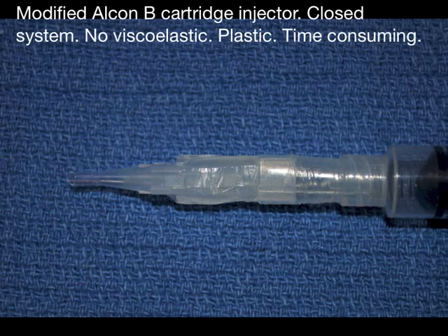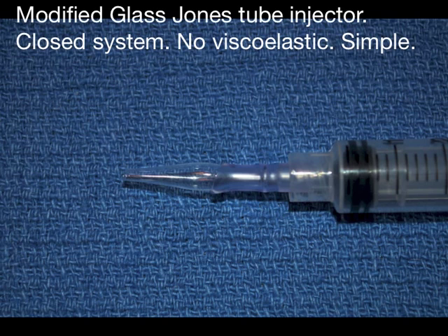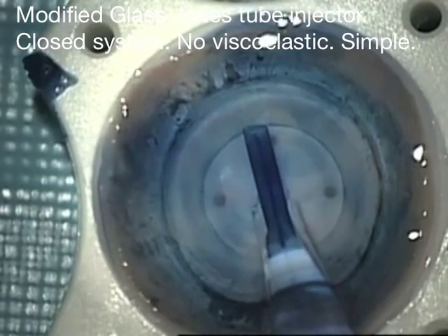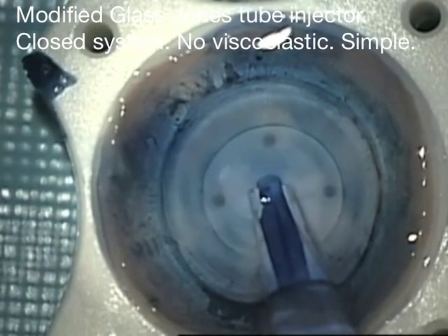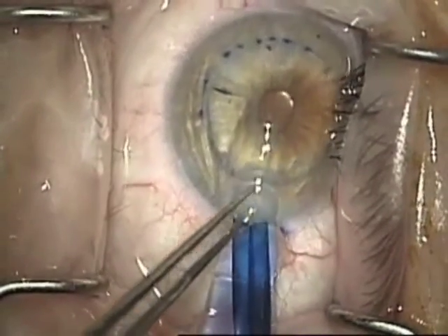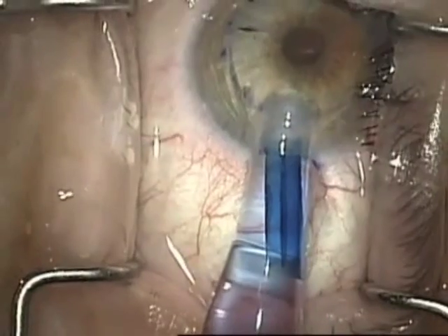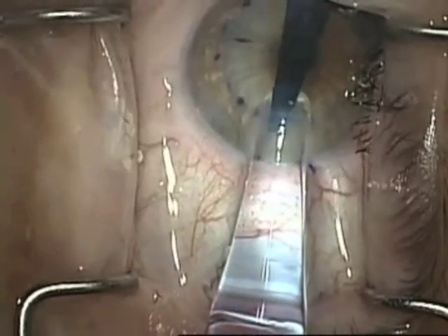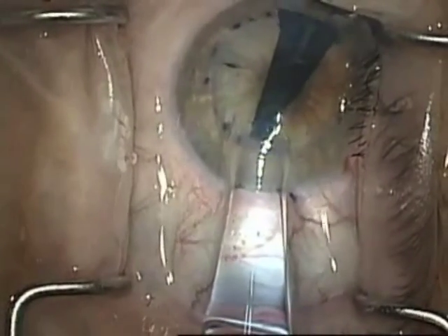Now, this is a modified Alcon B cartridge, also a closed system and worked very well, but required too much modification. So I came up with this glass-Jones tube system, which I've been much happier with. The glass-Jones tube system aspirates the graft very nicely, has a dilated area that prevents too much flow from aspirating the graft too far, and really helps the fluidics of the system.